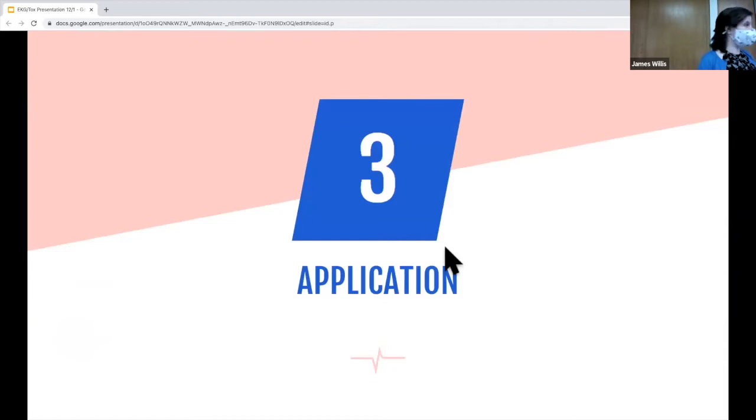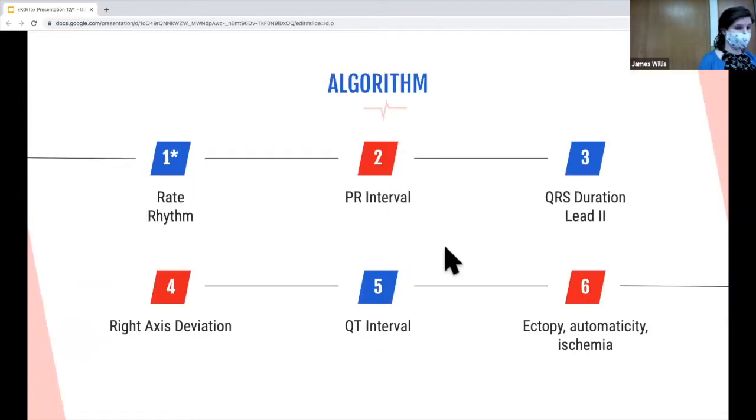So now we're going to apply this 6-step algorithm that I mentioned on the first couple of slides. If you were using this clinically and you wanted to kind of use the algorithms, you would use them in step 1. Otherwise, we're going to do this 6-step process for some EKGs and then talk about the cardiotoxic medications. So audience participation is required.